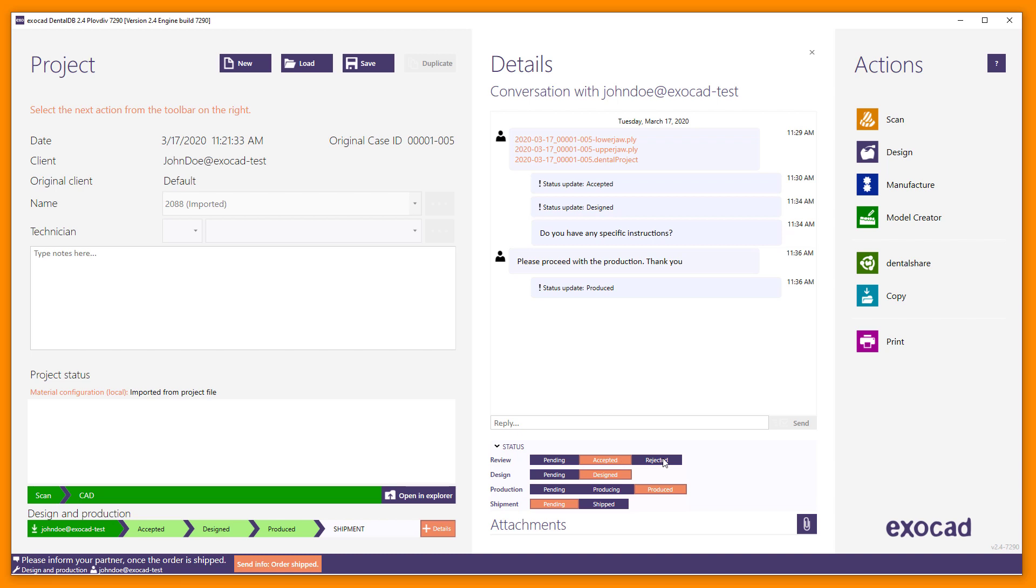Recipients have the additional option to manually send status updates using the Status section. If an order was already accepted, it can still be rejected here. When rejecting a review order, you must additionally type in a message into the text field. Status section shows different status updates. Further communication options are available in Details window such as sending file attachments and project related data.